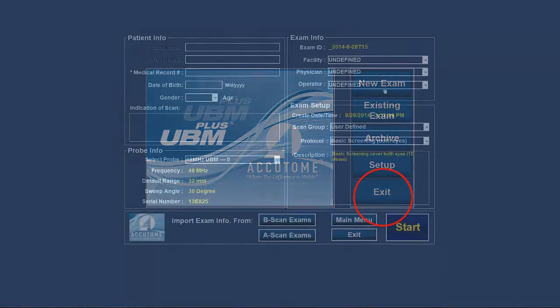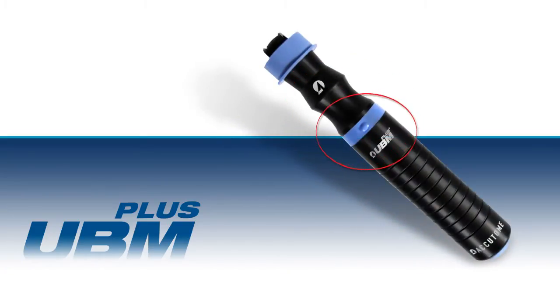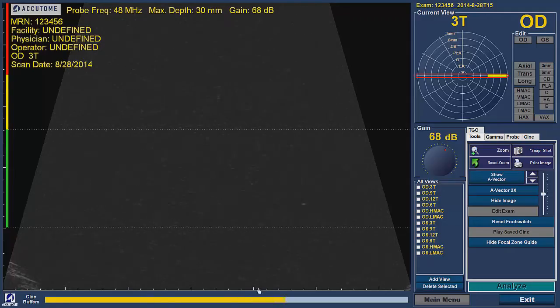Click on the New Exam tab and fill out the patient demographic information. Once the information is entered, press Start. The program will now enter the measurement screen. In this mode, images can be acquired by pressing the button on the probe or by pressing down the foot switch. Once pressed, a yellow marker will move across the screen and an image should appear.